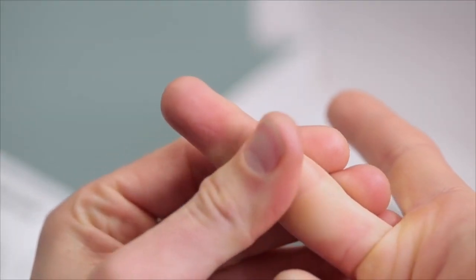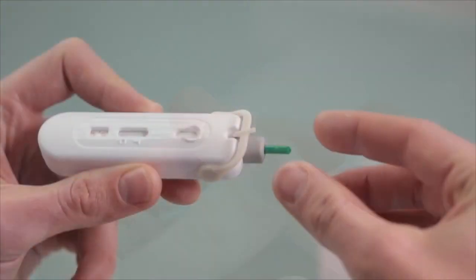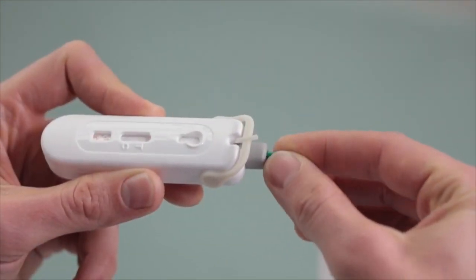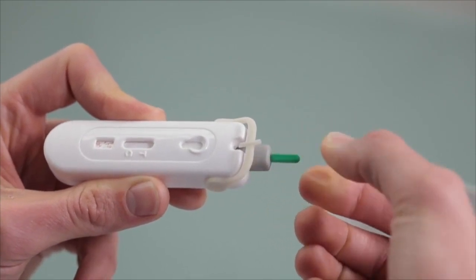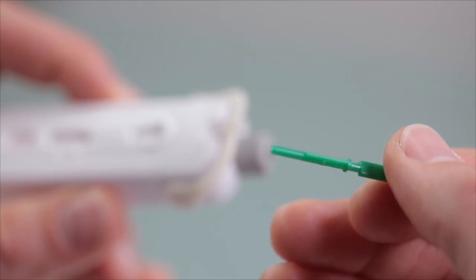Select a finger and massage downward towards the fingertip for 5 to 10 seconds to get the blood flowing. To remove the green tab, first gently turn. Then take it out. Now discard it.